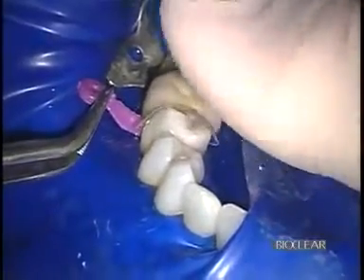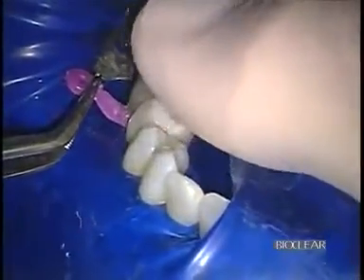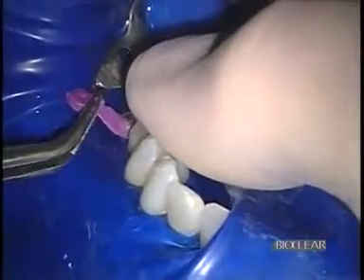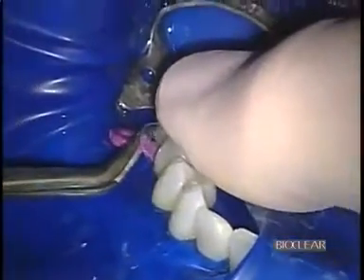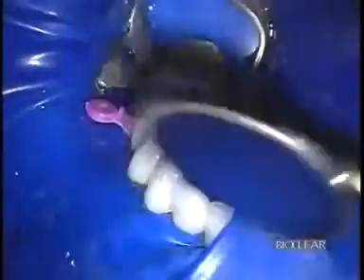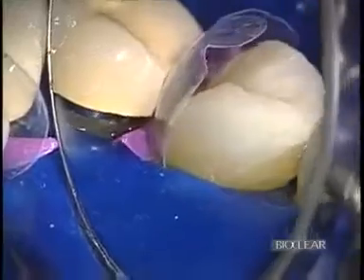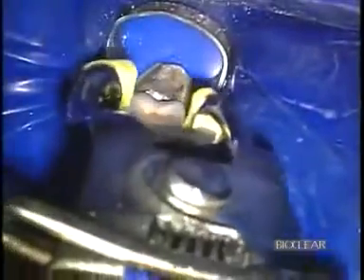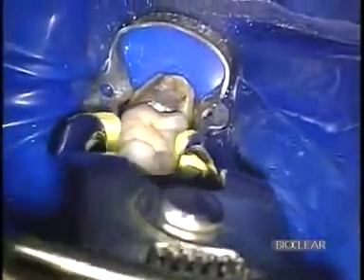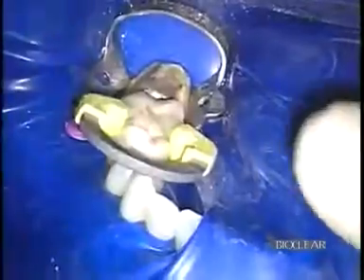Notice that I am removing the wedge, repositioning the matrix, and then replacing the wedge to make sure that everything is deep enough. In this particular case, I was also preparing a crown on the neighboring tooth, so the contact was artificially difficult to reach, but it is a good demonstration of a difficult contact and a deep, large preparation where an interproximator would not have worked well.